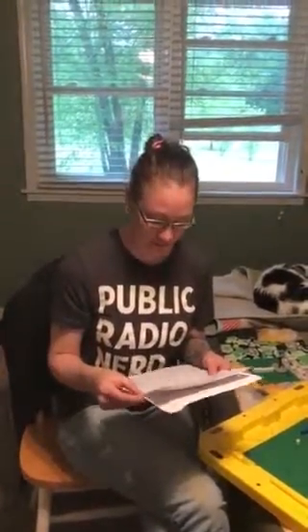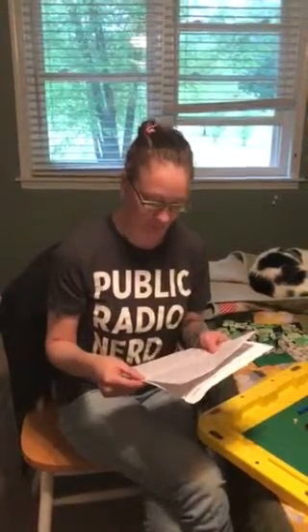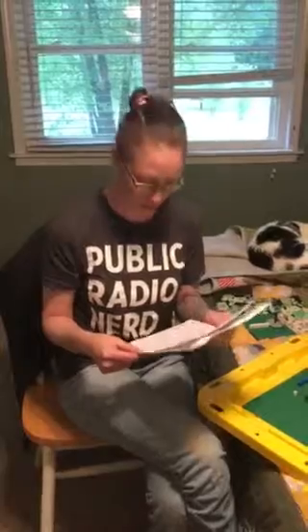So in the gradient echo sequence, the first negative gradient on the X line dephases the MR magnetic vector in the transverse plane. This is the dephasing gradient. Directly after the dephasing gradient, a positive gradient is applied to refocus or rephase the MR spins to create a gradient echo at the TE. The GY, or phase encoding gradient, is to create an echo line in K-space, and the GZ, or slice select, is designed to excite a single slice of interest during the initial RF pulse.